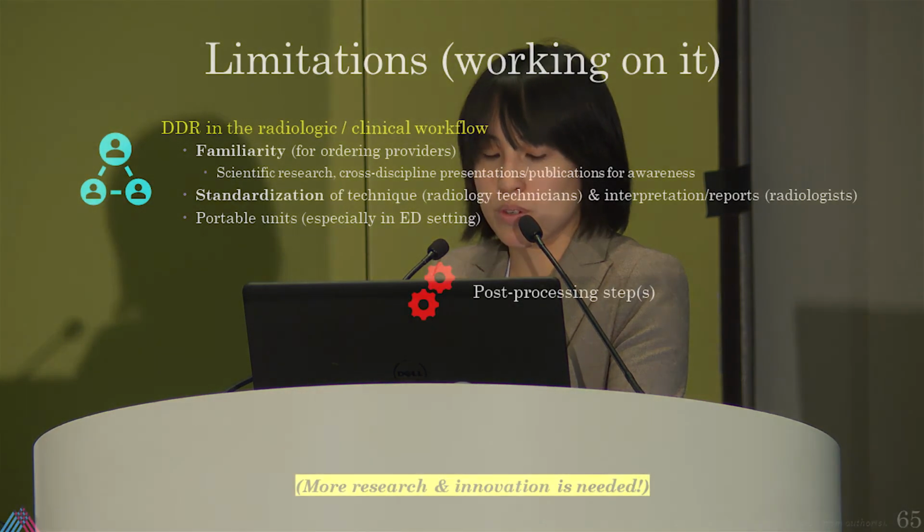You also need to maybe develop portable units so that it can be rolled out in the ED setting. Again, I may have alluded to this in the beginning, but you have someone standing getting an AP radiograph in a very standard technique for regular radiographs, but a lot of radiography is also done in a portable manner, and a lot of the emergency applications I discussed would be much better with a portable unit.